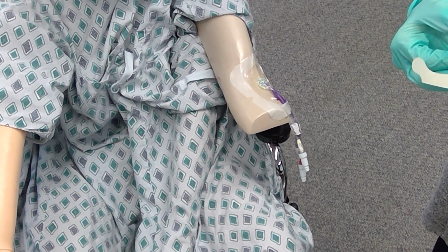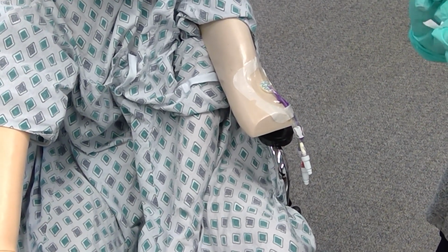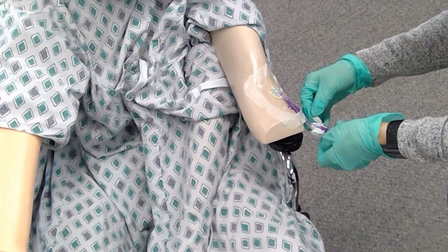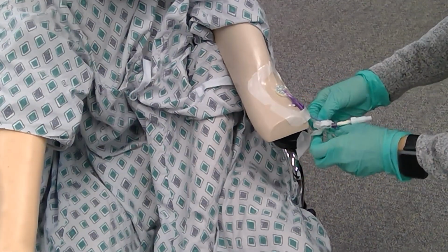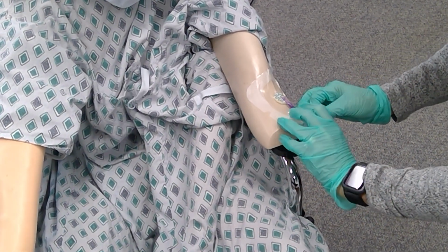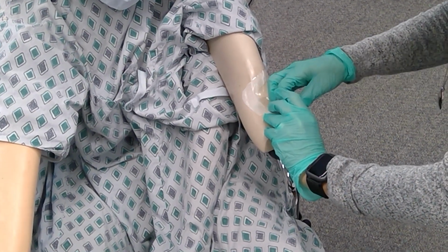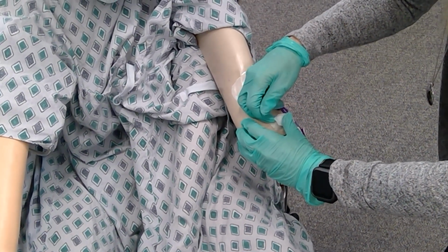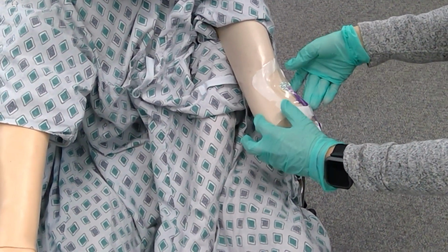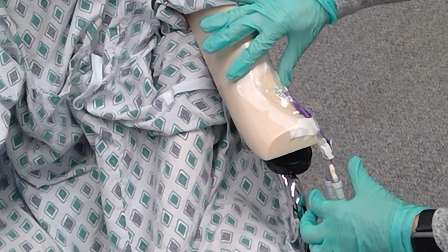This last piece is very sticky, and it's going to go up underneath the tubing. As a securement, in case that patient pulls on that line, it's going to secure that line.